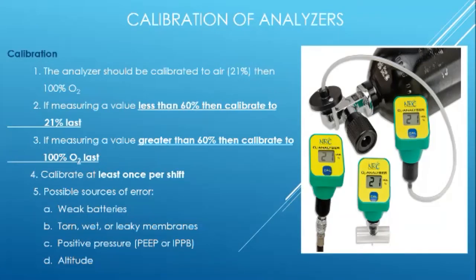You know how it says ERR? And you're like, well, what's wrong? Well, check the batteries. It may be a torn, wet, or leaky membrane. It may be that they're on positive pressure or in a higher altitude. Okay? That is the lesson.